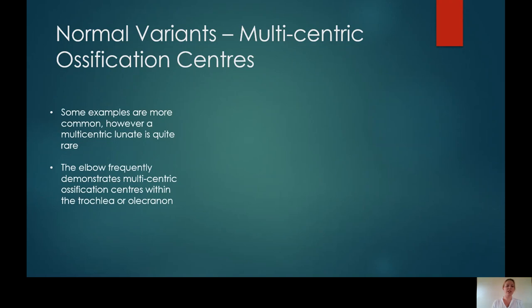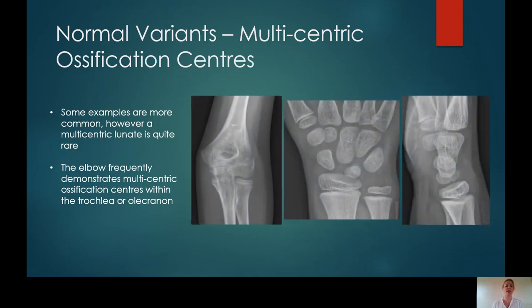Another example of a normal variant is multicentric ossification centres. The elbow frequently demonstrates multicentric ossification centres. Here you can see an example of a multicentric trochlear where it looks very fragmented — this is normal for the patient. There is also an example of a multicentric lunate, which is rarer. Ossification centres within children don't all form the same, and if you x-ray the other side, it may not look the same. These appearances are smooth and well-corticated. They don't look like fractures.